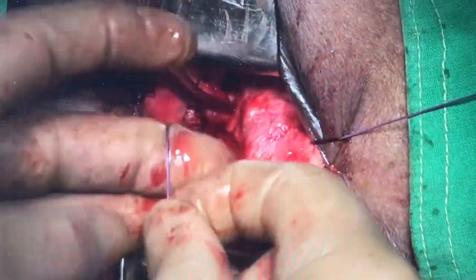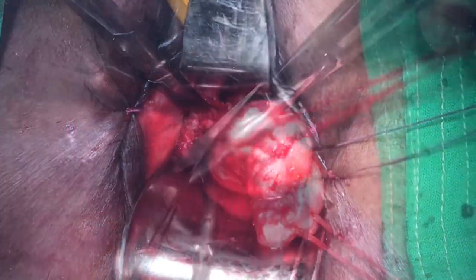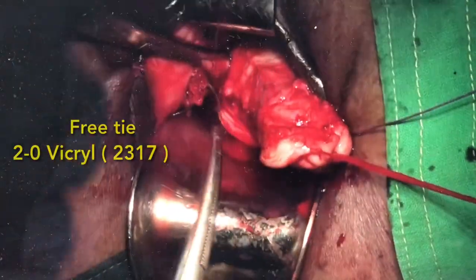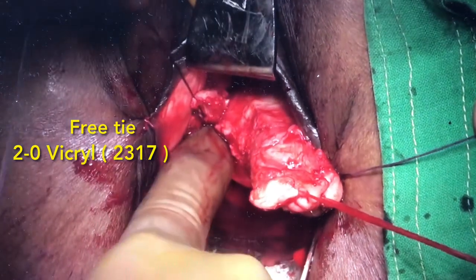Some people prefer only one single stitch for transfixation. Now, with a 2-0 Vicryl, we are going around as a free tie. The free tie is placed medial or lateral to the transfixation suture.